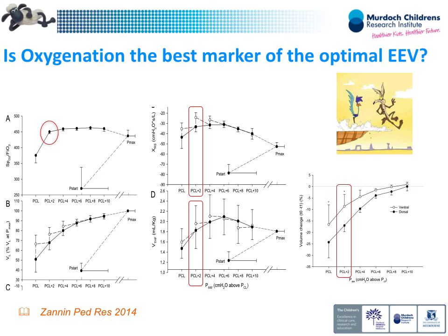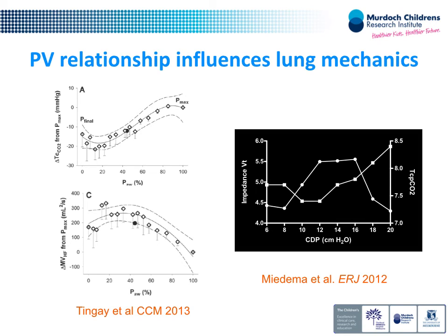And this suggests that maybe adding in these markers that we now have on the ventilator might help us know we're about to step off the cliff and make those of us who are anxious about atelectasis at least transiently less anxious. And both, again from Anton's group, showed here TcCO2 and EIT in measured tidal volume as we go from a low pressure up and from a high pressure down after recruitment. You can see that there's this relationship in these parameters. Sorry, this is just your deflation data, my mistake. So this is going from a high pressure then down to the closing pressure.